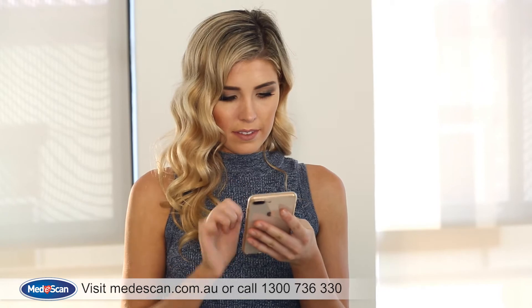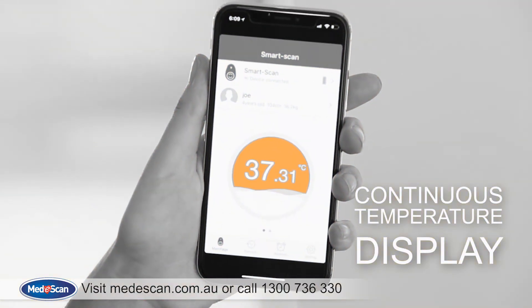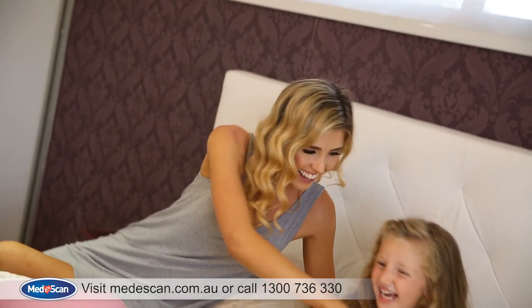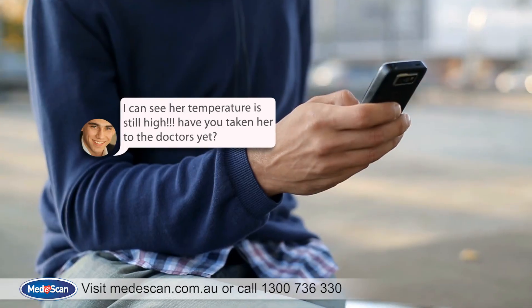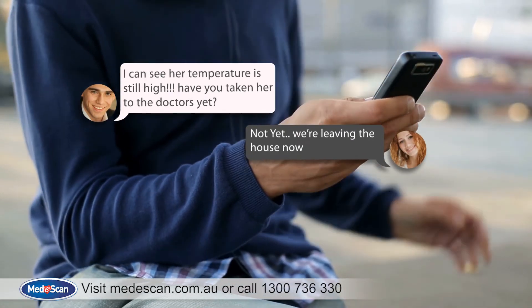Once the connection is established, the temperature reading will be transmitted to the SmartScan app on your mobile device immediately via Bluetooth. With your phone staying within Bluetooth range of the SmartScan thermometer, a secondary device can simply log in using the remote login option to monitor the patient's temperature remotely.